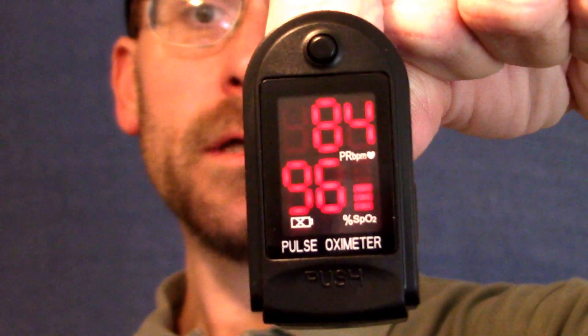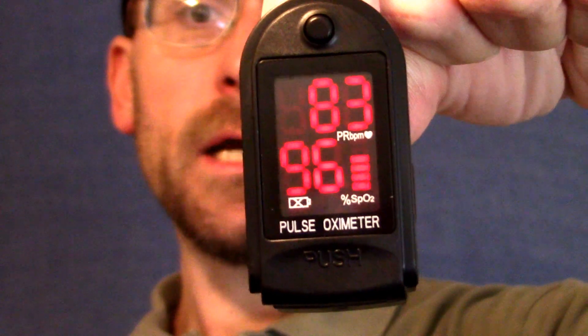Which currently is showing 83 to 84 on the pulse and 96 on the oxygen. So we're in good shape.